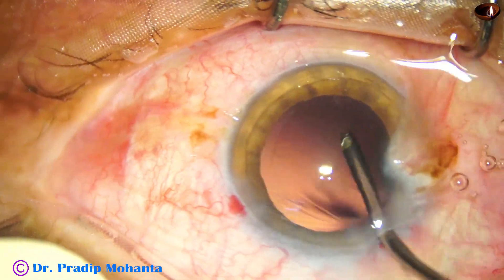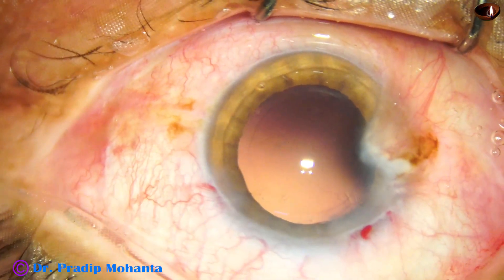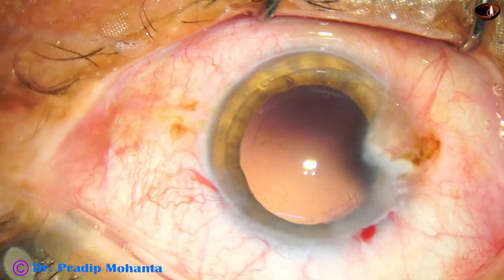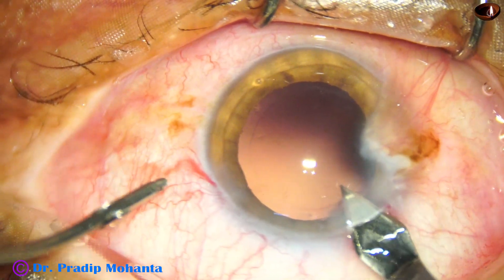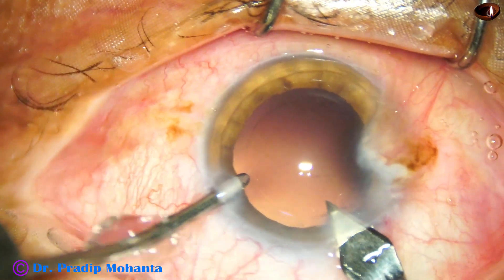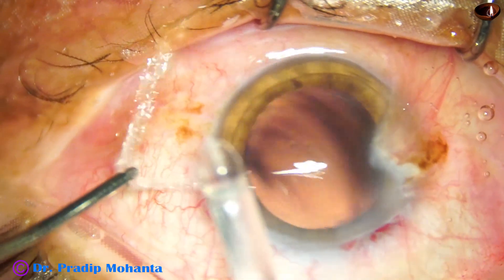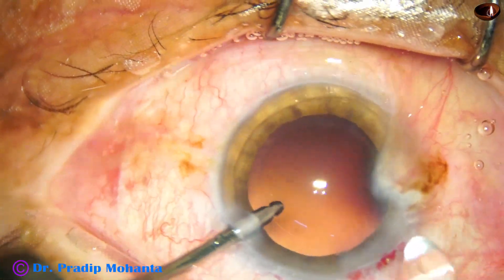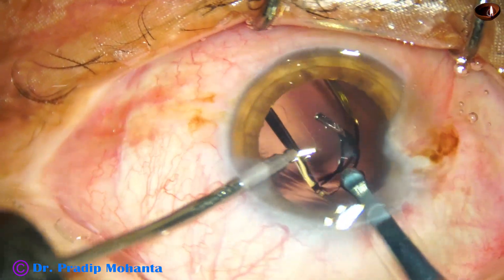Before that, this is hydro-polish — just using the irrigating jet of fluid to polish the posterior capsule. Now this is hydro-implantation. Before that I am enlarging the main incision a little bit because I am using a big cartridge.